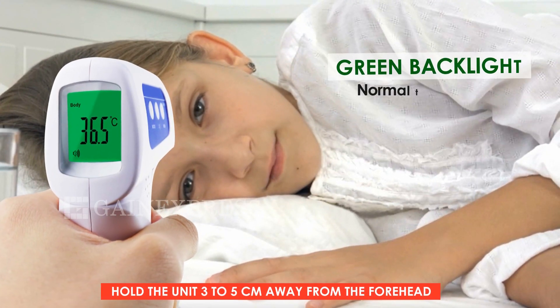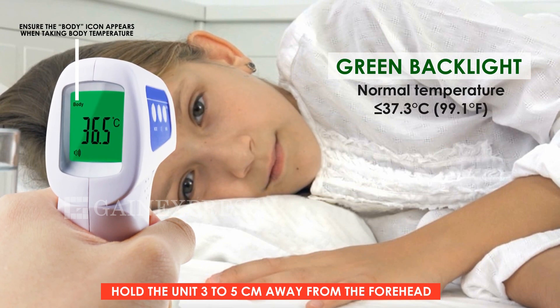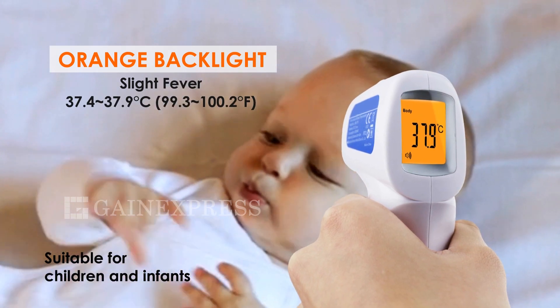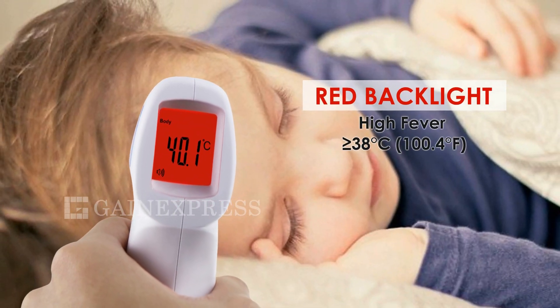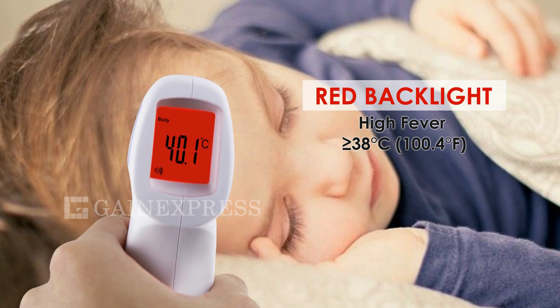In body temperature mode, green backlight means the temperature is normal. Ensure the body icon appears when taking temperature. The subject has slight fever if the backlight turns to orange. This thermometer is suitable for children and infants. Red backlight is for high fever, 38 degrees Celsius and above.